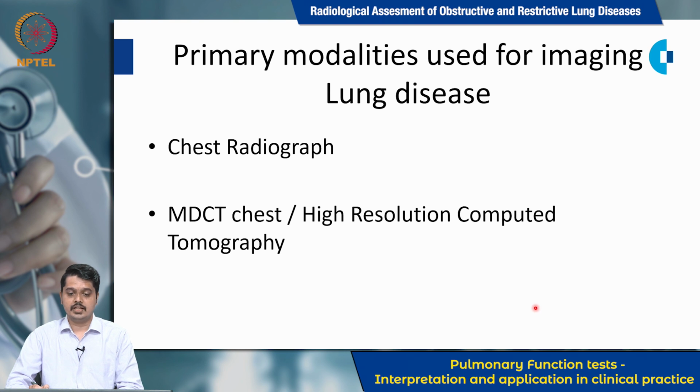First, we shall see the modalities we commonly use for imaging lung diseases. First is chest X-ray, next is MDCT or high resolution CT or HRCT.